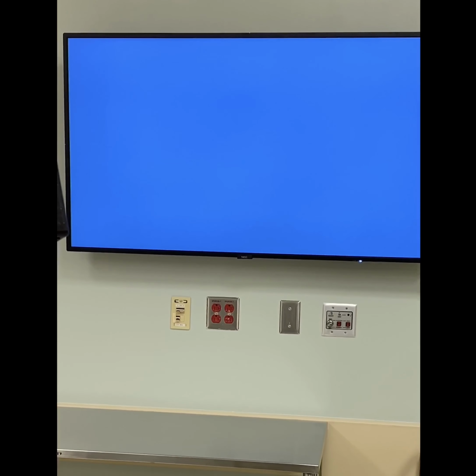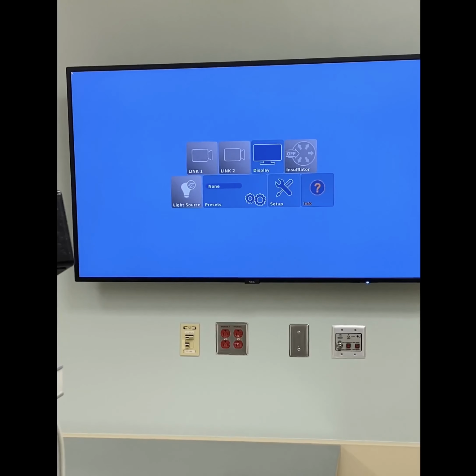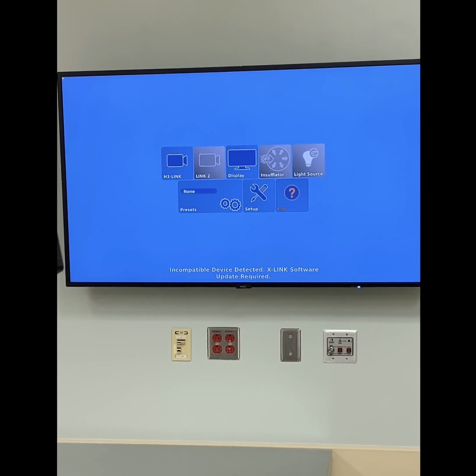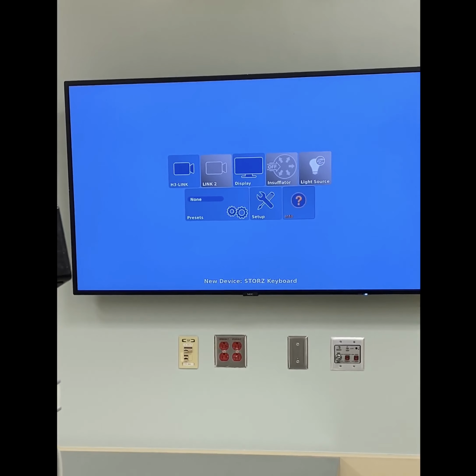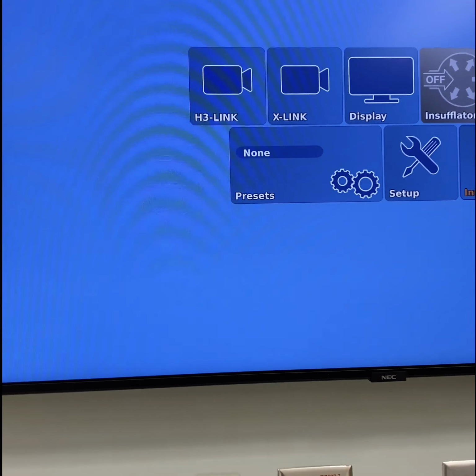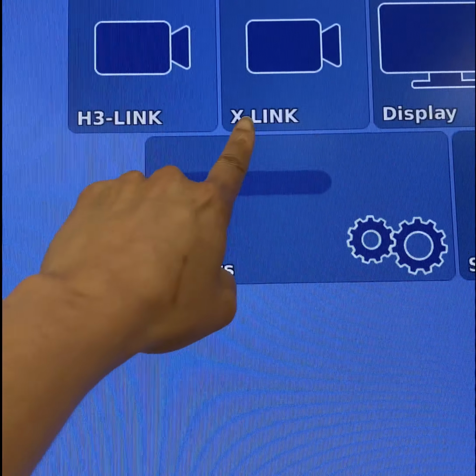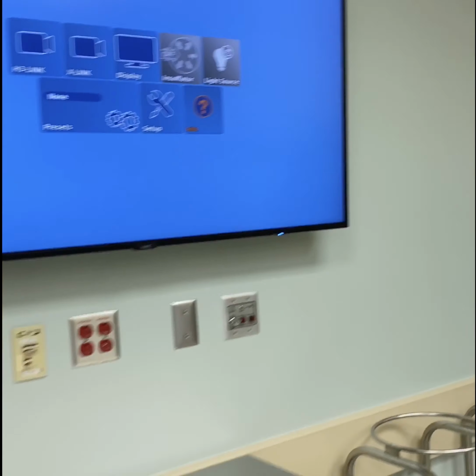And we're waiting. While we're waiting, we have to make sure that the digital ureteroscope is open, there's nothing missing from it, and it's not broken or anything. Okay, so now we have the screen. As you can see, where it says Link 2 and H3 Link. Now the second box here has changed from Link 2 and it now says X Link. So now your equipment is ready.